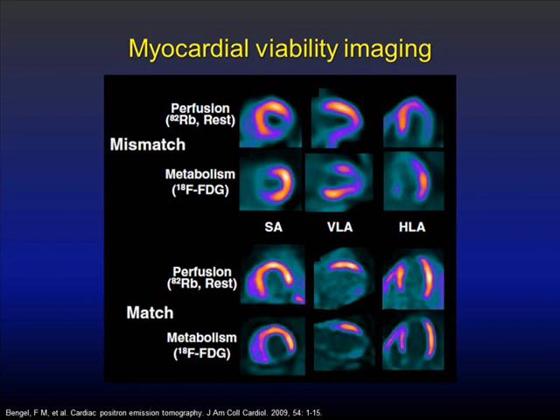Another application in myocardial imaging is, we're running over, aren't we? What is the image you're looking at right on that previous slide exactly? Yeah, it's difficult sometimes to present, but basically if you think of the heart along this axis, we're slicing it like a donut, and we're looking at slices of it. Okay. So it's not the whole heart, it's always a slice of the chamber? Right, right.